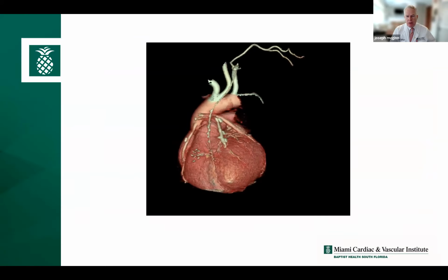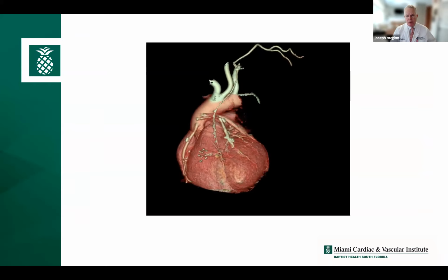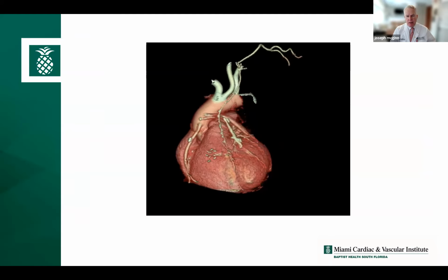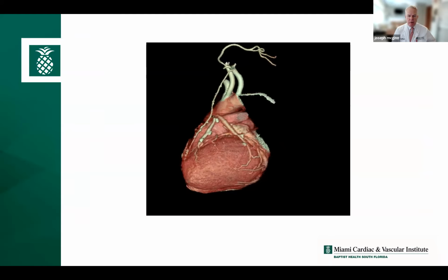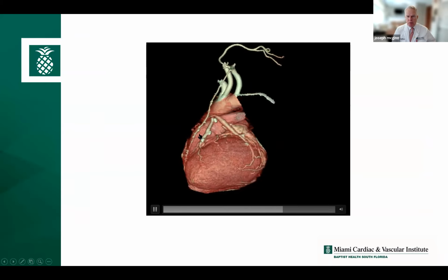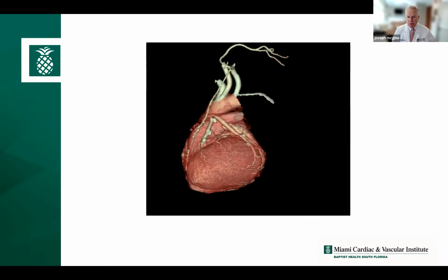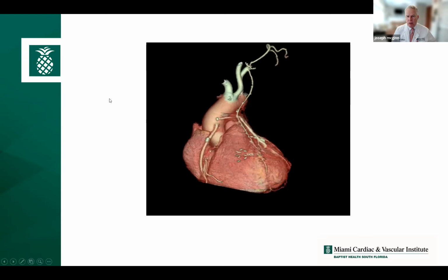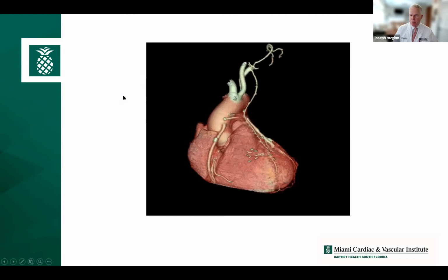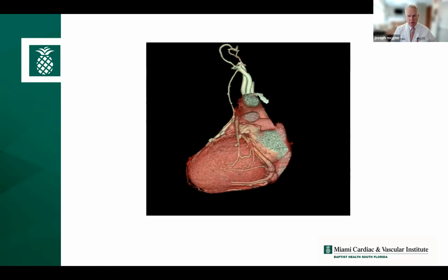Okay, so I want to show this, and I show this to all the surgeons that visit. The reason I show this is because this is a CAT scan of a patient who had a minimally invasive coronary bypass. You can see the arteries and veins that are bypassed here on the heart. If you compare it to the open case that's done through a sternotomy, you'll find that the CAT scans look almost indistinguishable, because what we're doing through the little incision is almost exactly the same operation. We're just doing it through some small holes using some very ingenious devices to move the heart around and stabilize the arteries.